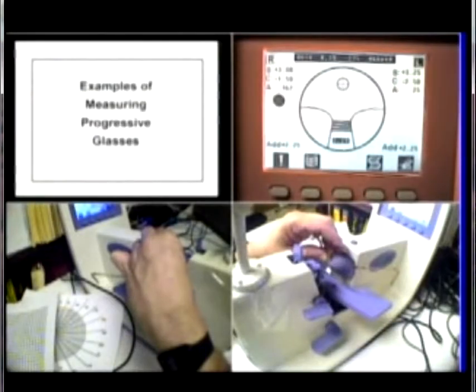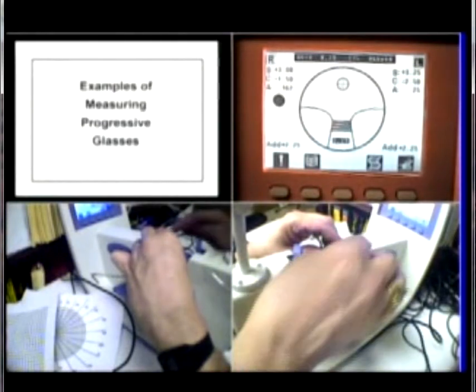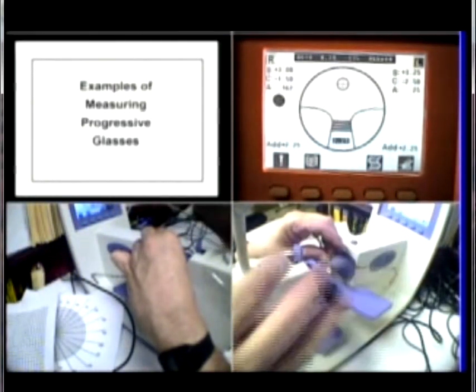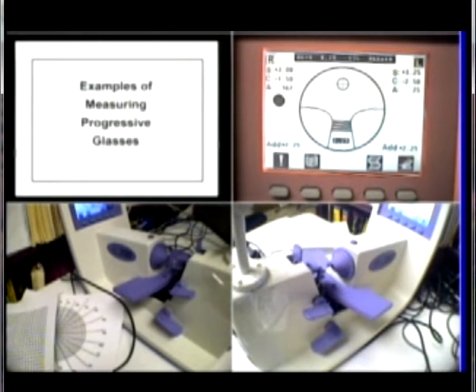You can go to the quad mode. I'm going to reach across and press the memorize button. And now I've got a measurement for the right and the left eye.